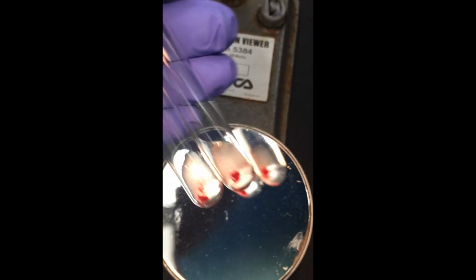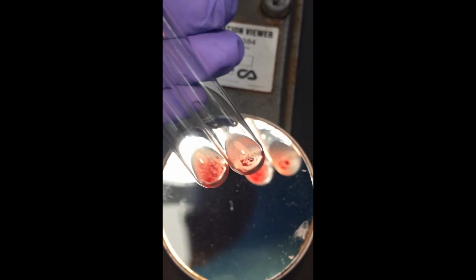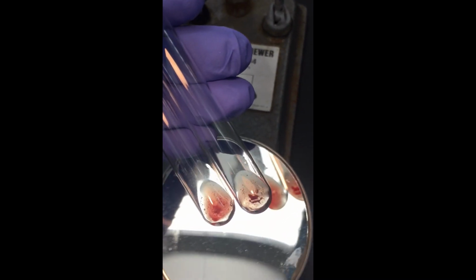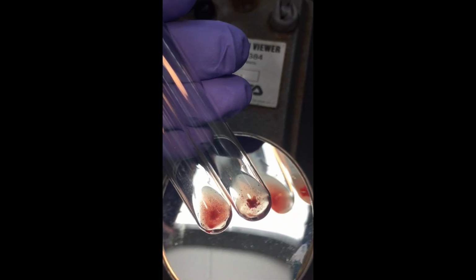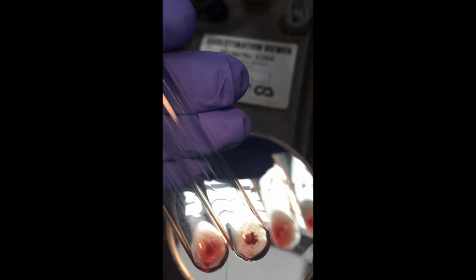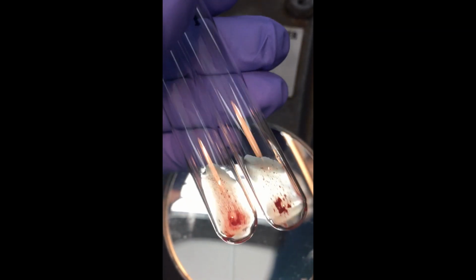The last step, of course, is our check cells to all negative tubes. So if you had a negative at AHG and you read it microscopically and you thought that you saw agglutination, then you would put plus minus, because you didn't see it visually, you only saw it under the microscope. So it always would be a plus minus there.